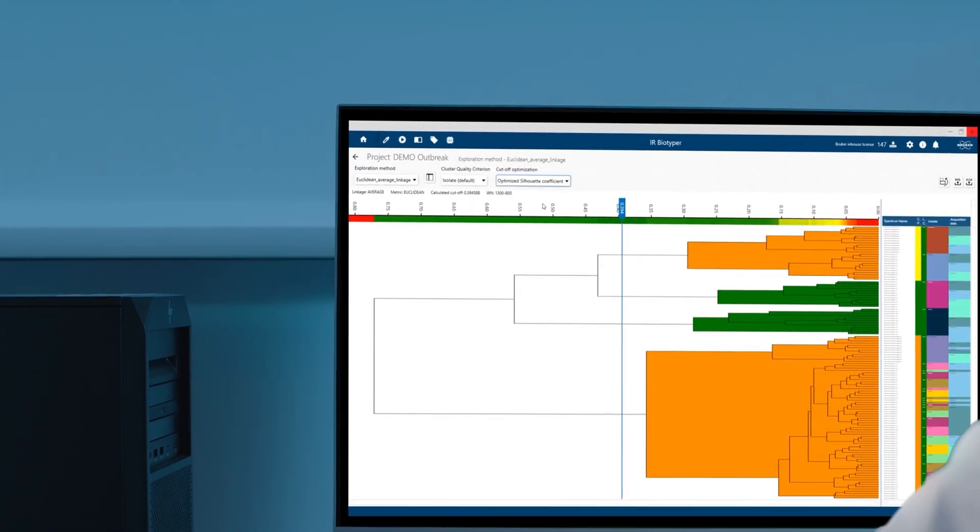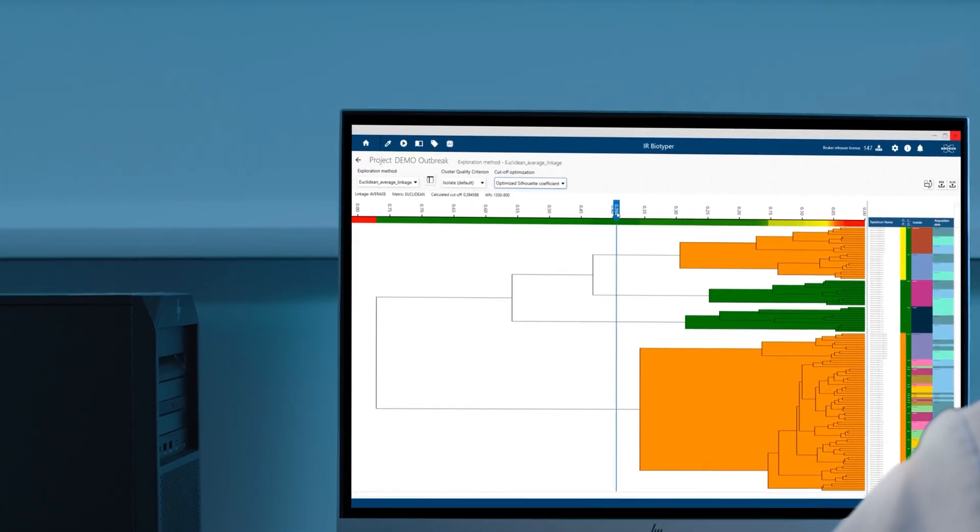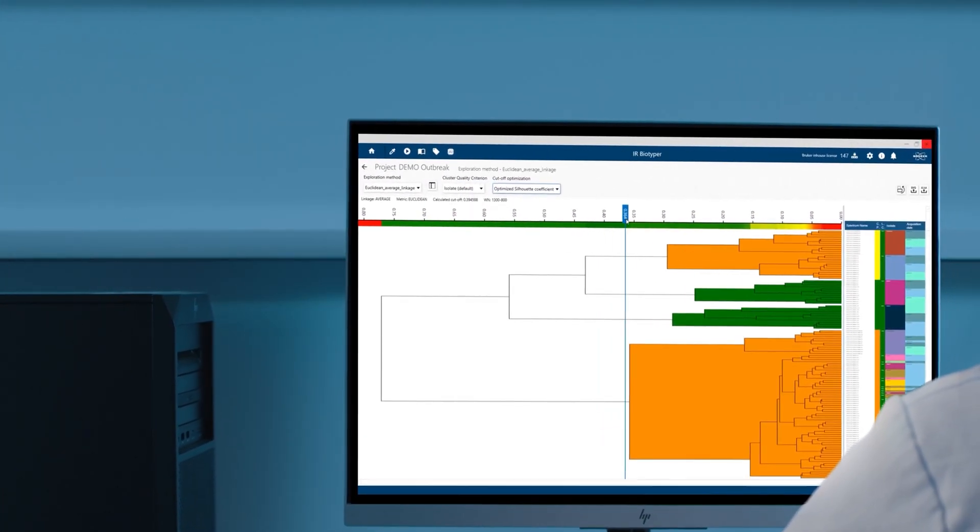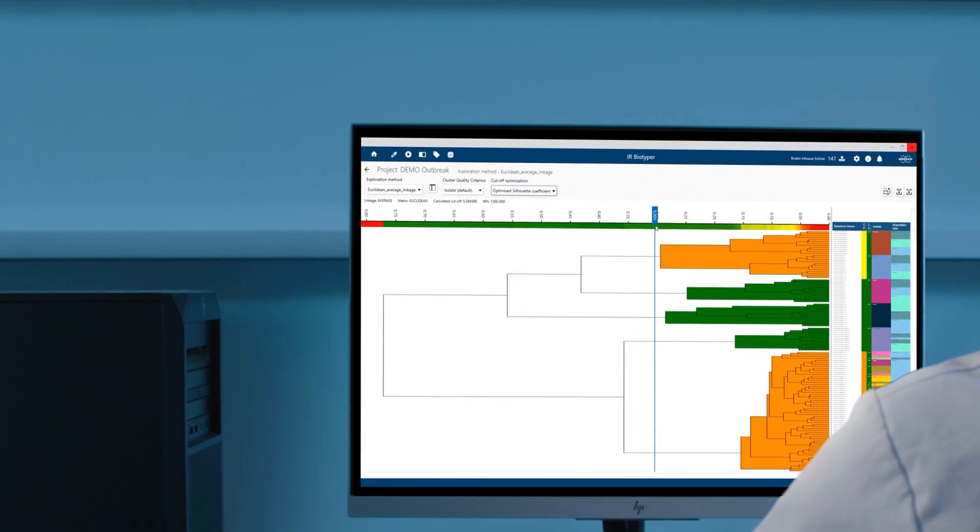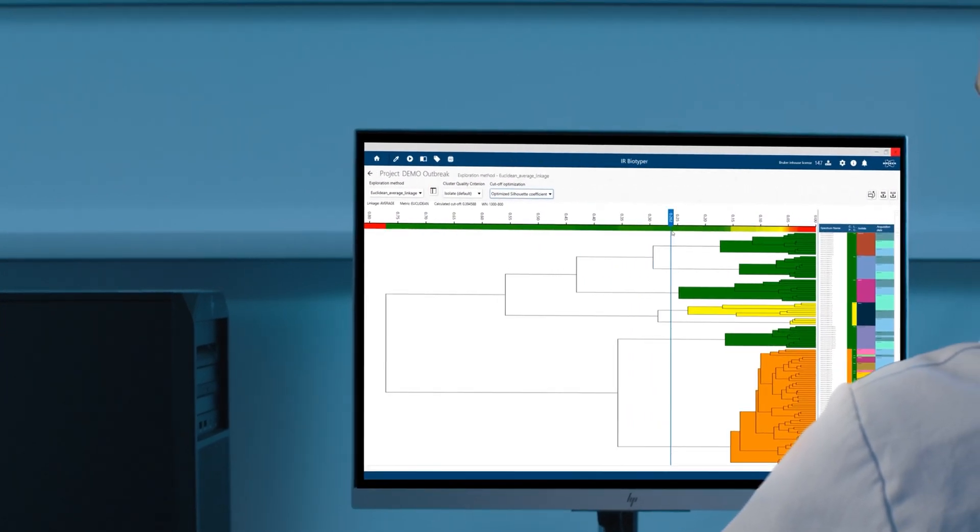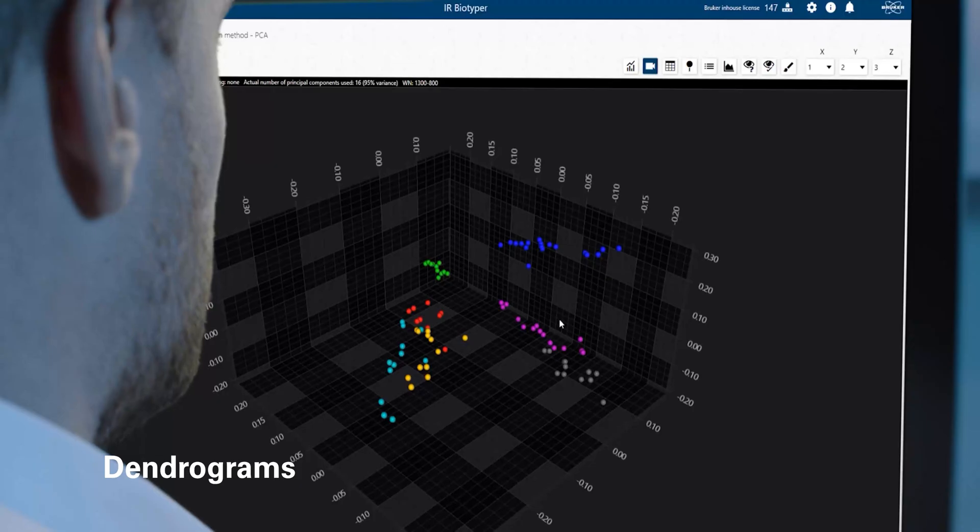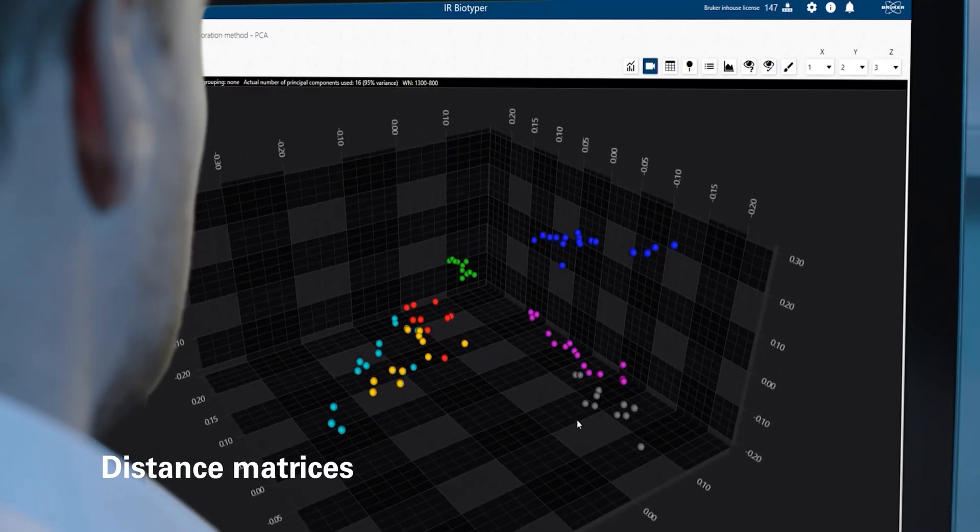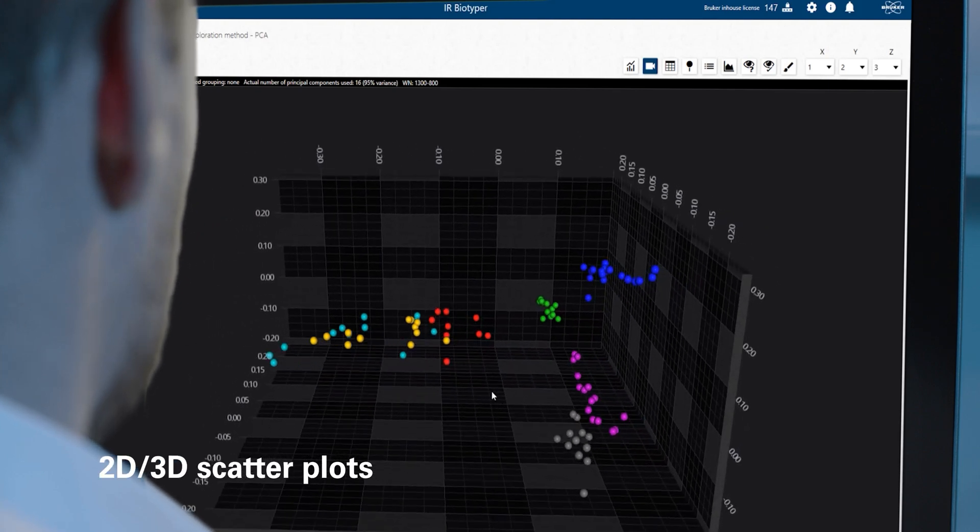Isolate clustering, equivalent to molecular methods, is visualized through convenient tools such as dendrograms, distance matrices, and scatter plots.